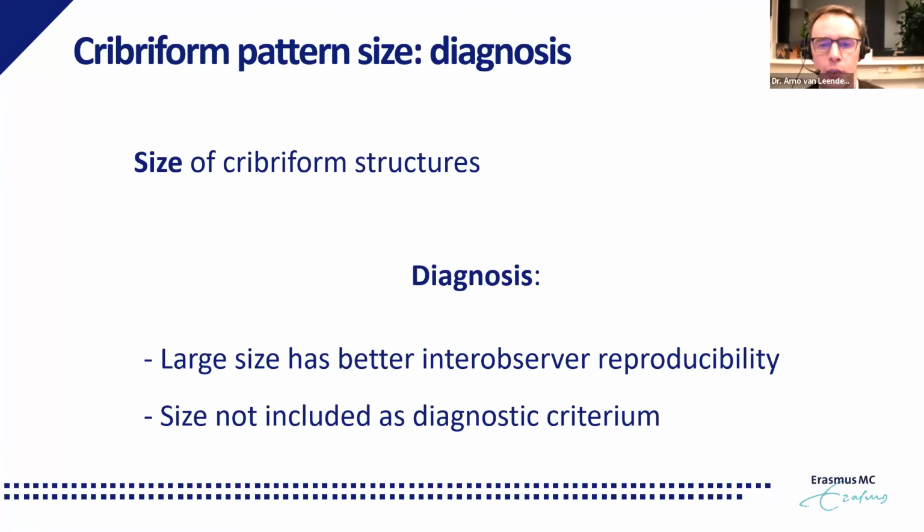This can look quite close and might resemble fused glands, but in fused glands, if you look closely, all the tumor cells are still touching stroma. And that's not the case in cribriform pattern. So probably genomic alterations that are acquired by the atypical cells allow them to grow without any stromal contact anymore.